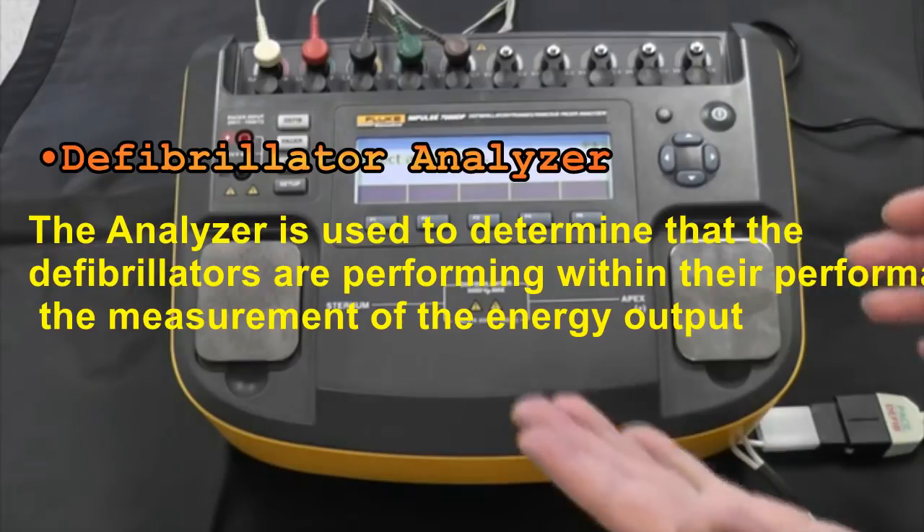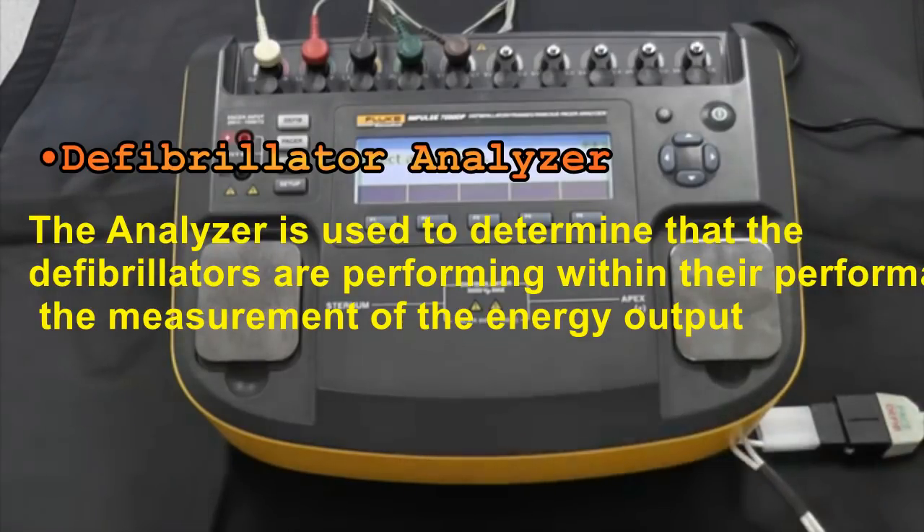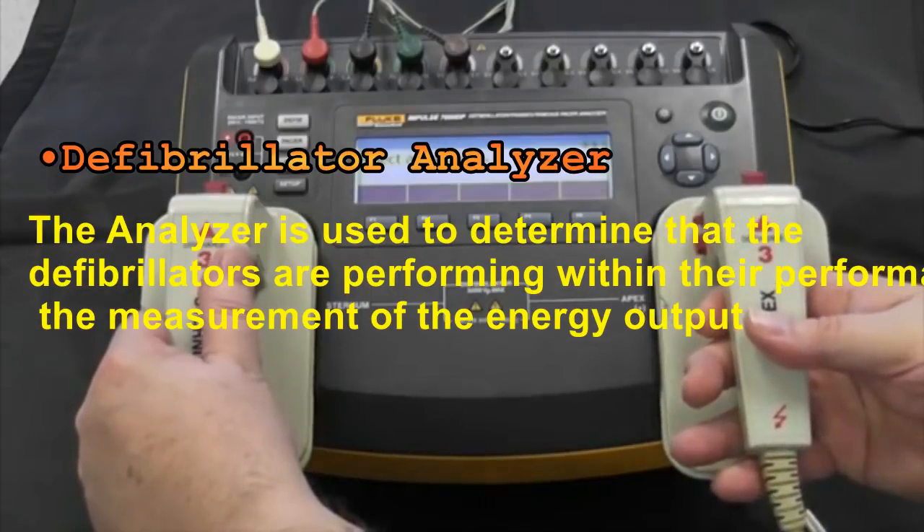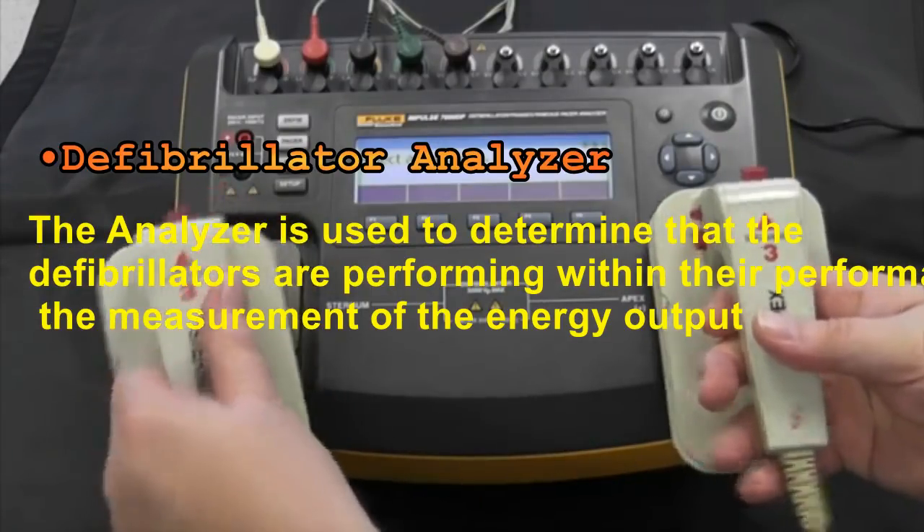As you can see here, we have it set up with the plates. If you're going to use paddles, they just go right on the plates just like that for you to control the defib and deliver the energy.